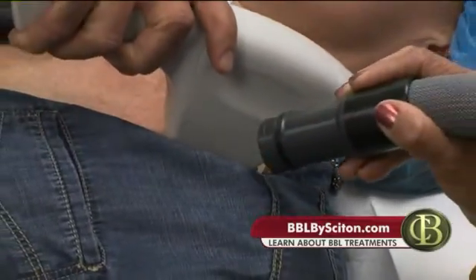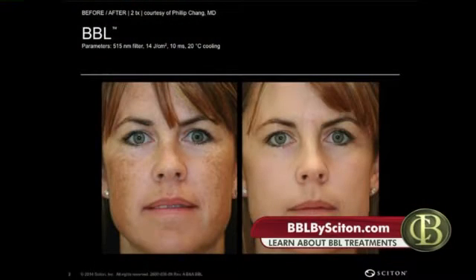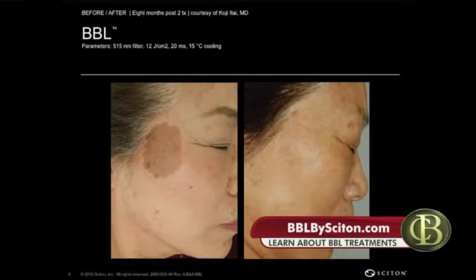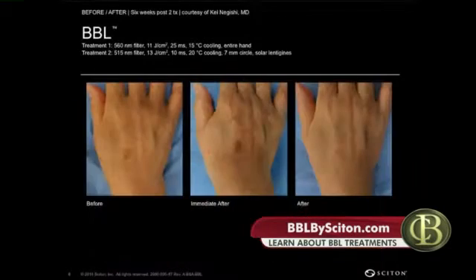So patients can have freckles or areas of little blood vessels or discoloration that maybe result from acne lesions, and we can really improve that using BBL. There's actually new research from Stanford and from a few other institutions that if you do BBL treatments on a regular basis, you can actually slow the appearance of aging. So you can keep skin in a condition where you're not seeing the lines and the wrinkles and the folds that develop traditionally with aging and sun-related changes.